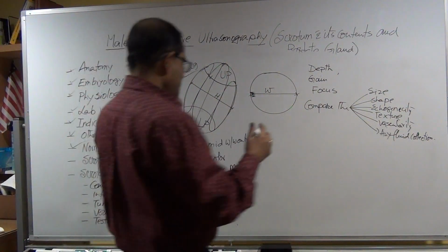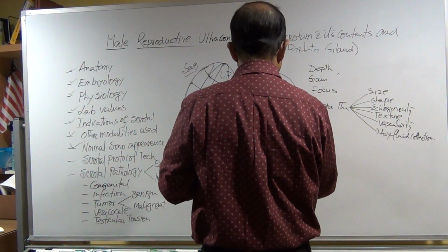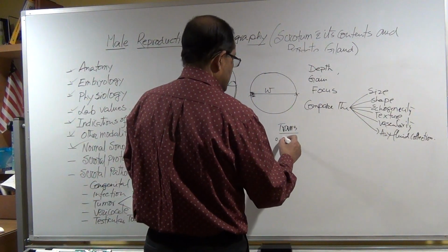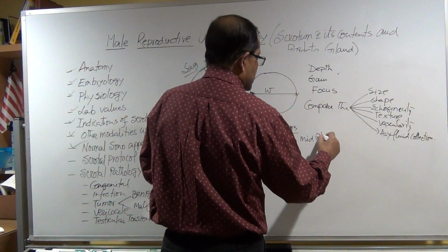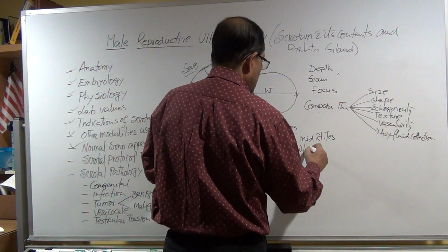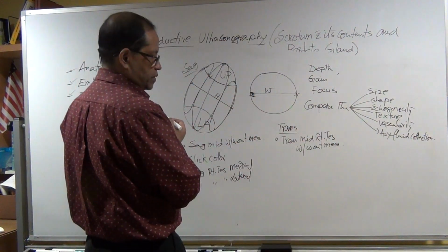So now, in transverse, take a picture, transverse right testis with or without measurement.